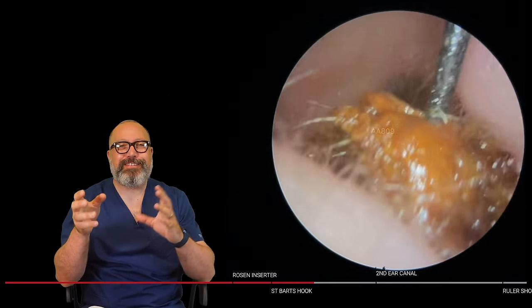Quite a sort of painstaking one to do as well, just because of the amount of wax in both ear canals. There we go. You can see that was quite a long piece there. Look at that coming away. Nice long strip there of dead skin. And when you're getting these pieces of dead skin away, it does make a difference because they do tend to bind the plug together, and they're forming the glue that's holding all these little bits together at the moment.